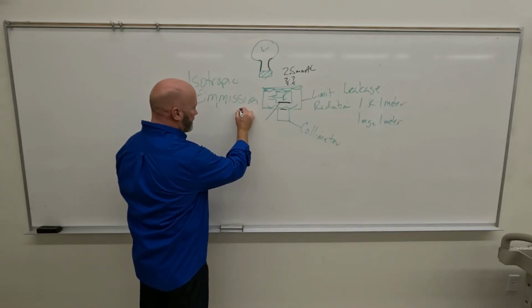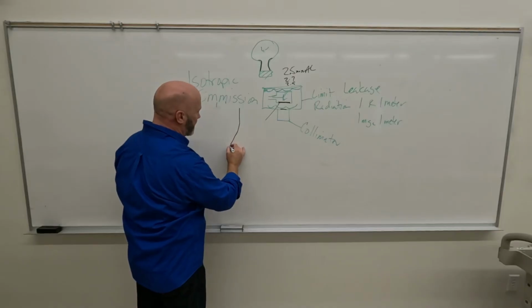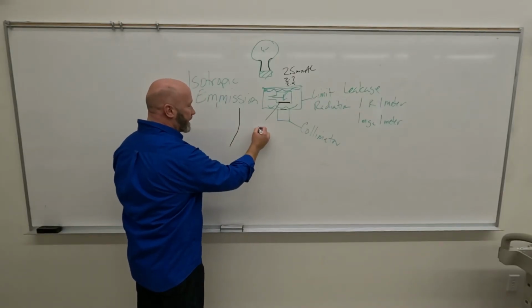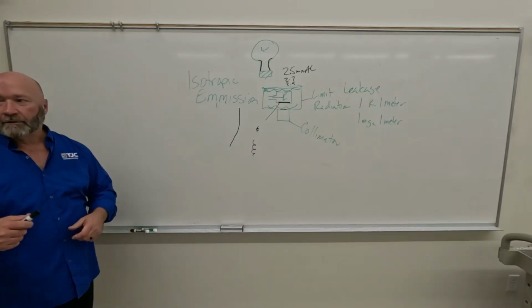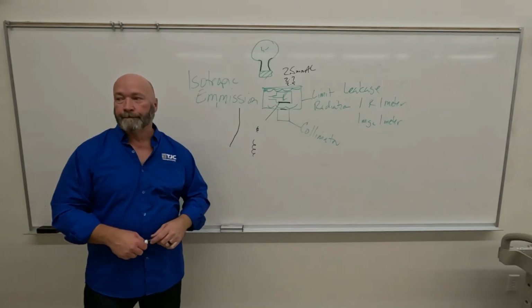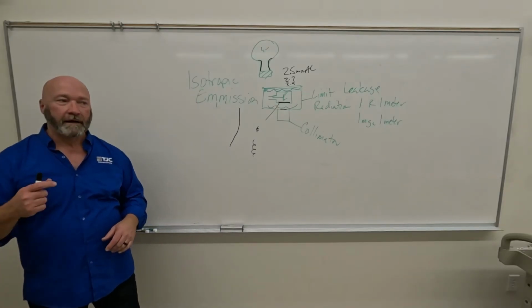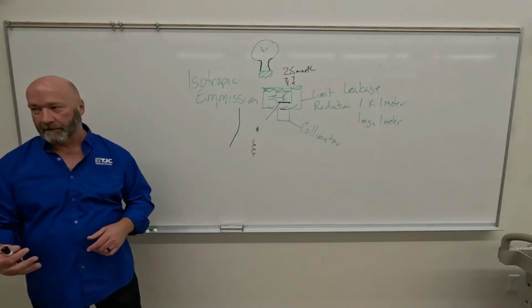that has two bevels on it, one very steep bevel and one less steep bevel. And in those cases, you've got a filament there and you've got a filament here. These are very specialized X-ray tubes, and unless you're working in a place where you've got very small, fractional focal spots, you're probably not going to be working with one of these.